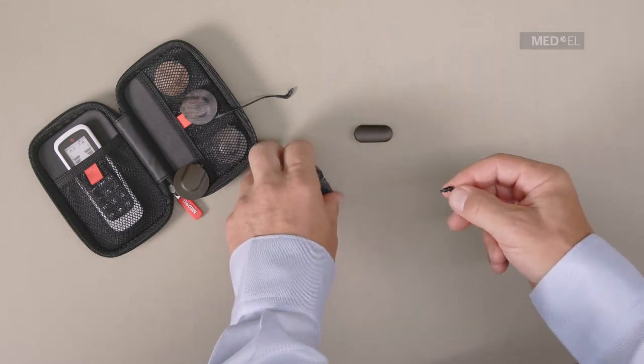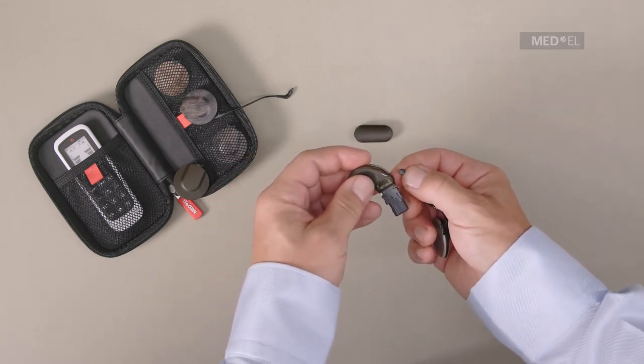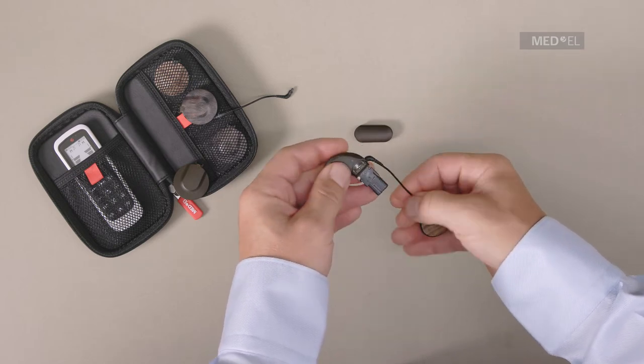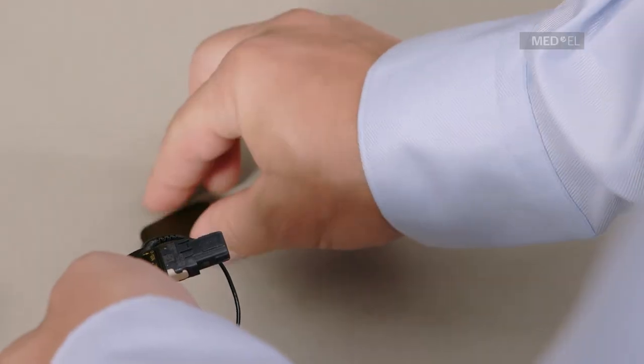Plug the new coil cable into the audio processor, noting the correct orientation of the coil cable plug. Finally, slide on the battery pack cover.